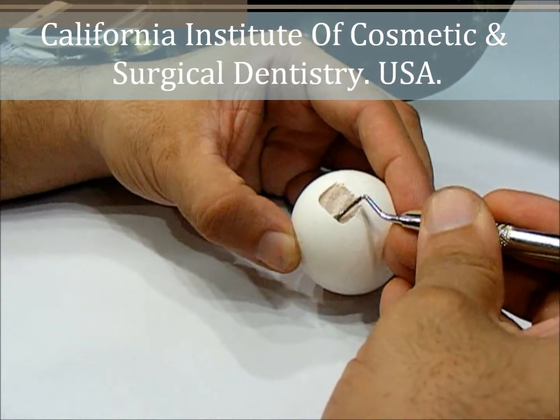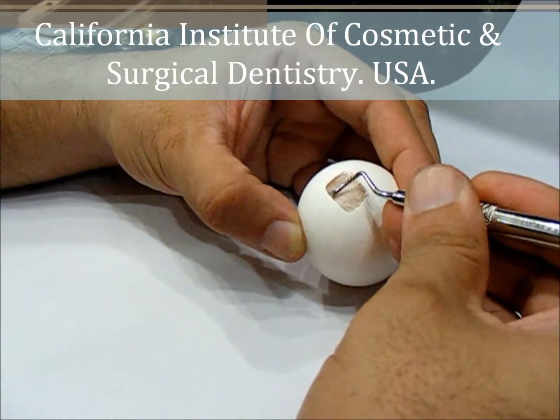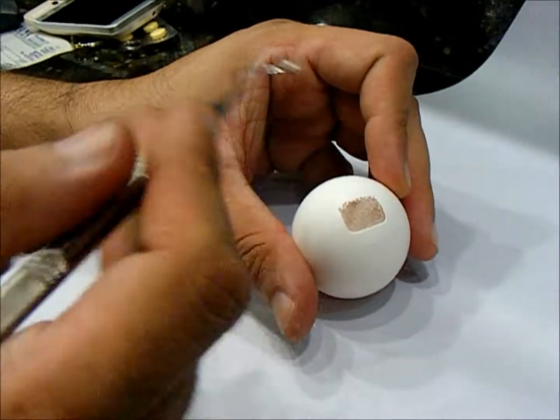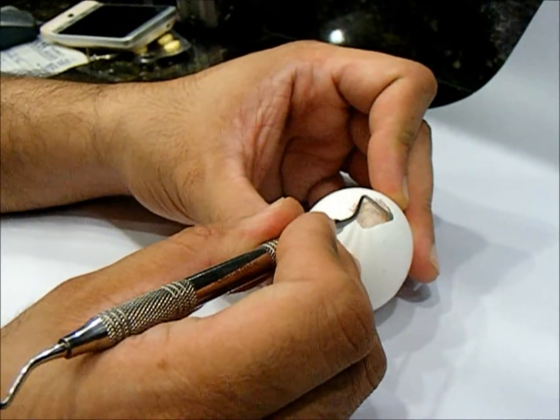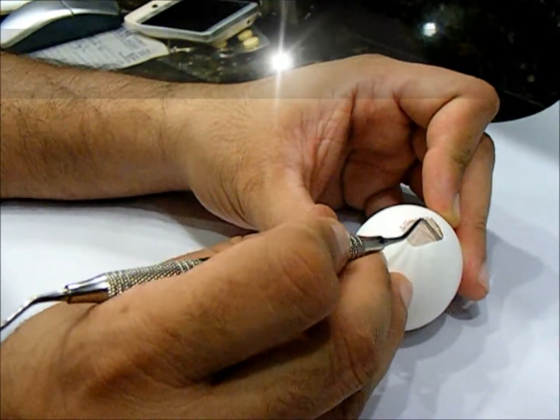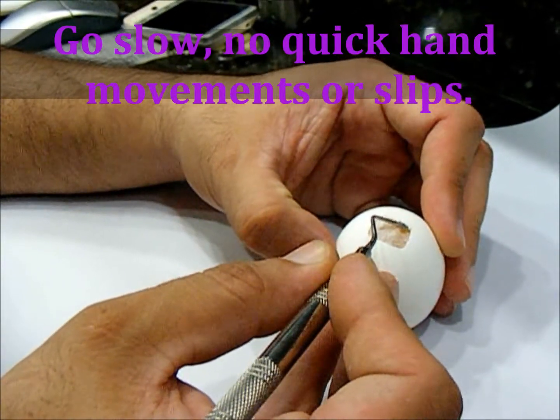In the sinus, although it is not really rough or abrupt, you do have hills and valleys inside. The sinus internal anatomy varies according to the roots of the teeth it had covered or may be covering at that time. It can also vary because of the number, amount, and thickness of bony septa inside the sinus. Remember, as it goes medially it rises toward the nose. Here I am going posteriorly — if there is tuberosity, then the maxilla is going to start curving upwards medially and slightly anteriorly, but in this practice session on the egg we don't have that problem.